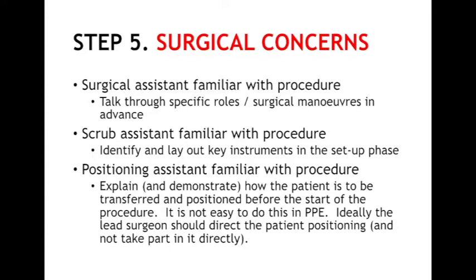The nominated positioning assistant should also understand the ideal patient position, particularly with regards to the neck and shoulder roll and head ring, so that maximum head extension can be obtained to facilitate surgical placement.